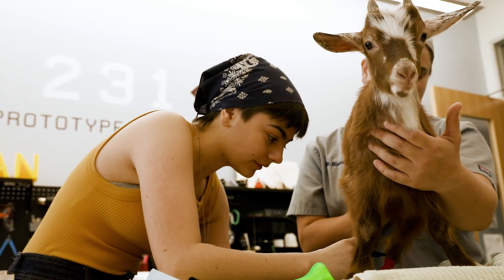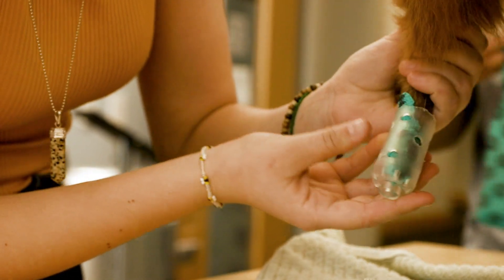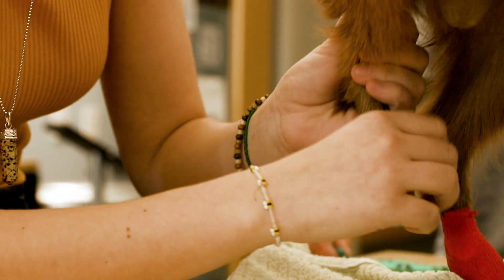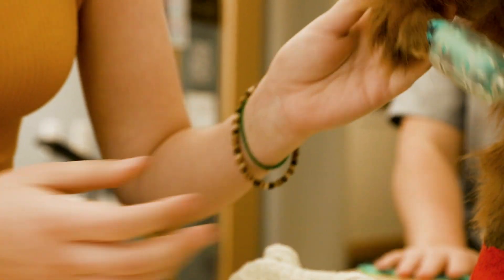This is actually where we ended up after the first iteration. One of the hardest things was figuring out how to keep the boot on, so we ended up designing a softer resin sock made on the material science department's high-quality resin printers. It's essentially a silicone material, and we designed it to have a bunch of pores in it so that it had a good flex.